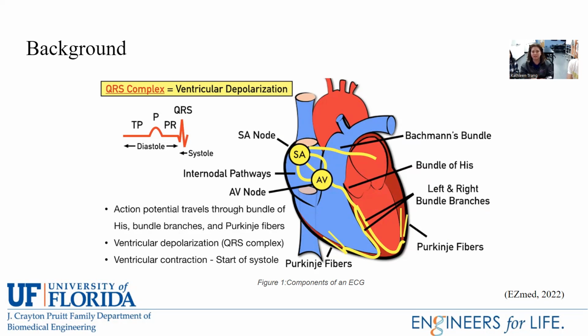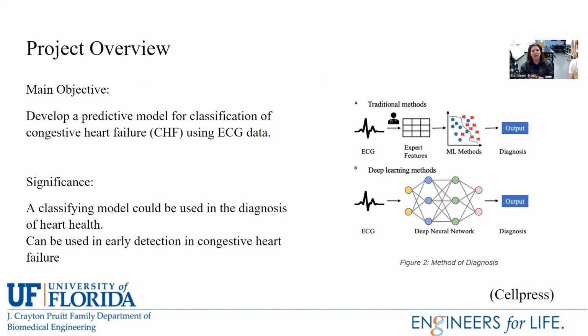The main objective of our project is to develop a predictive model for classification of congestive heart failure using ECG data. And the significance is that a classifying model can be used in diagnosis of heart health, and this will aid in early detection of congestive heart failure.